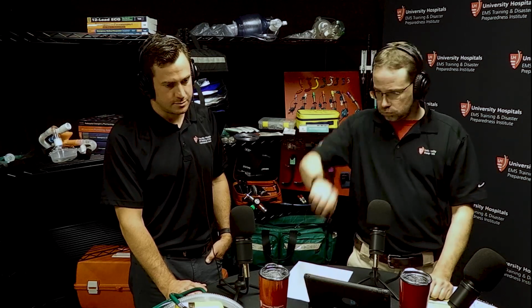So turn that up until you get sats you like. You're augmenting that. We know that's a downfall, a pitfall in that style of device, not even that brand. You said it's easily correctable. Yeah, dial it up, and don't be afraid of the higher flow. I hope after COVID nobody is scared of high flow anything up the nose, because we turn all the knobs on everything we have. Put that nasal cannula on at 15, and then pile a non-rebreather on top of that at 15, or 20 or 25. Turn till it stops, but assuming they need it, right?